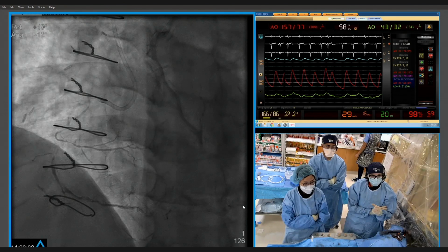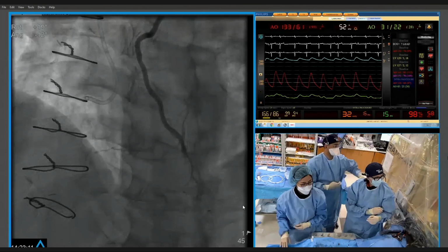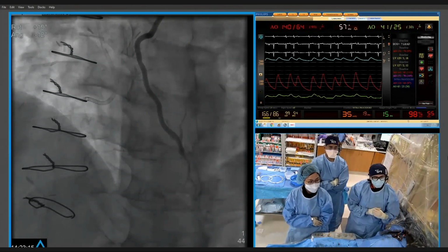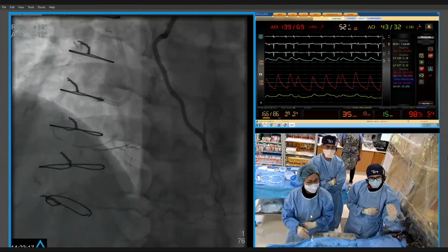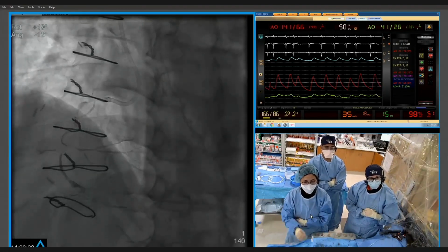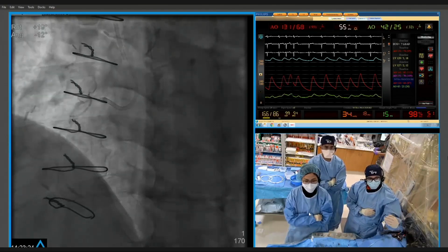Then, as Ajay says, as you come round in the distal right, we can see where the graft was attached. And then we don't see the PD from the antegrade, from the retrograde filling, but we get the sense of where the PD is coming off that PLV right at the very end there.